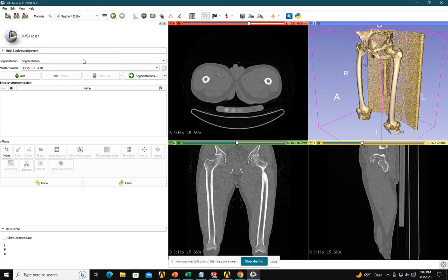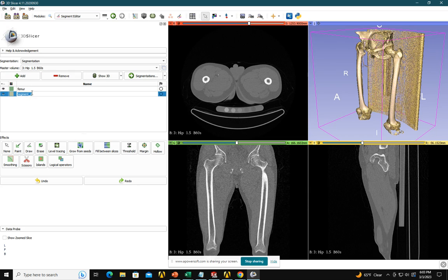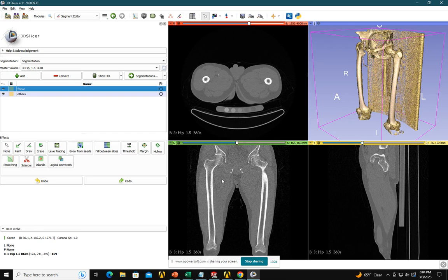I have to segment it — Segment Editor. I want to segment it as a femur, and I need another segment called 'others.' Even if you just create the femur segment, that will be fine. Let's work on the femur first. The first thing is the threshold value — the pixel value of bone is different than muscle, right? So I will go by the threshold.